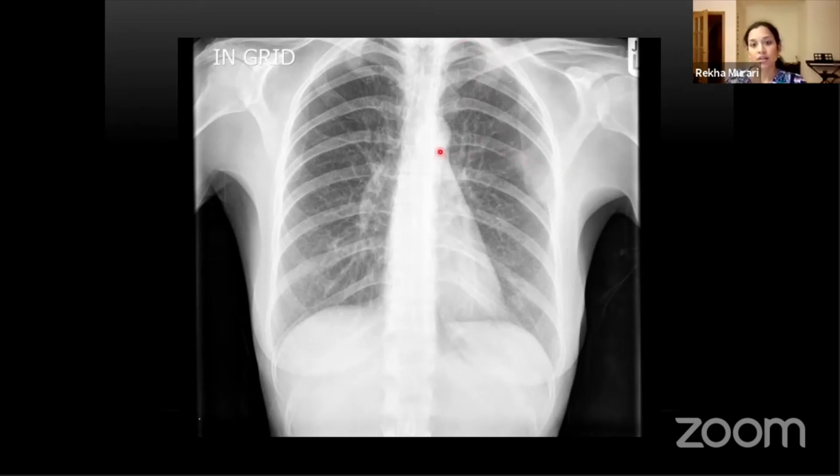So can you see, the cortex should always be traced with a pencil. And you can see there, and then suddenly you kind of lose it. And then it's kind of expansile there. So if I draw around it, so that is a metastasis on the rib.